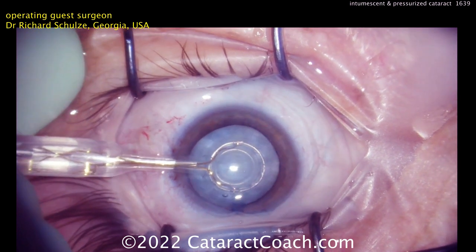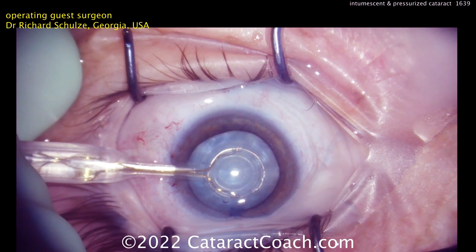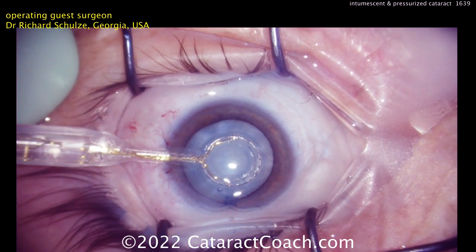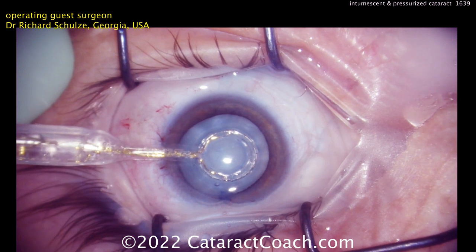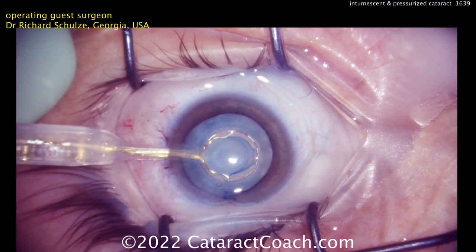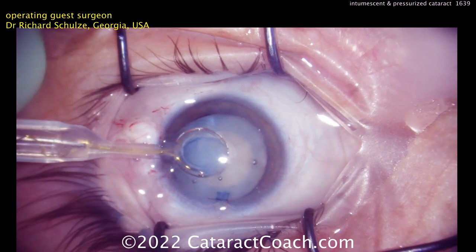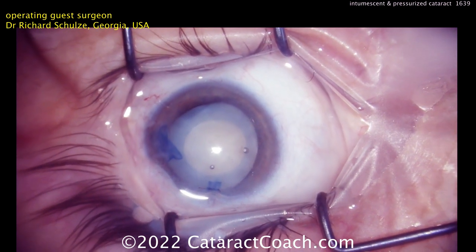Once centered, you apply suction to the device — your technician can do this or you can use a foot pedal. With strong suction secured, you instruct the nurse or step on a pedal to deliver a brief pulse of energy. The energy is very minimal — just four milliseconds. The suction is applied, the device is very still, and the four-millisecond burst instantly creates the rhexis, preventing any runout. It also sends a small pulse of fluid to help dissect off residual cortex. Then the nitinol ring is removed.